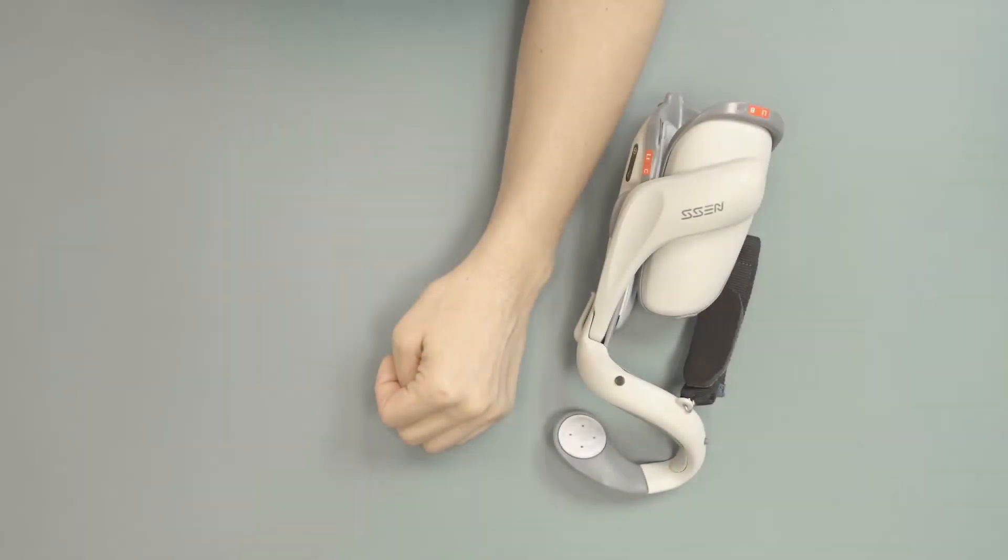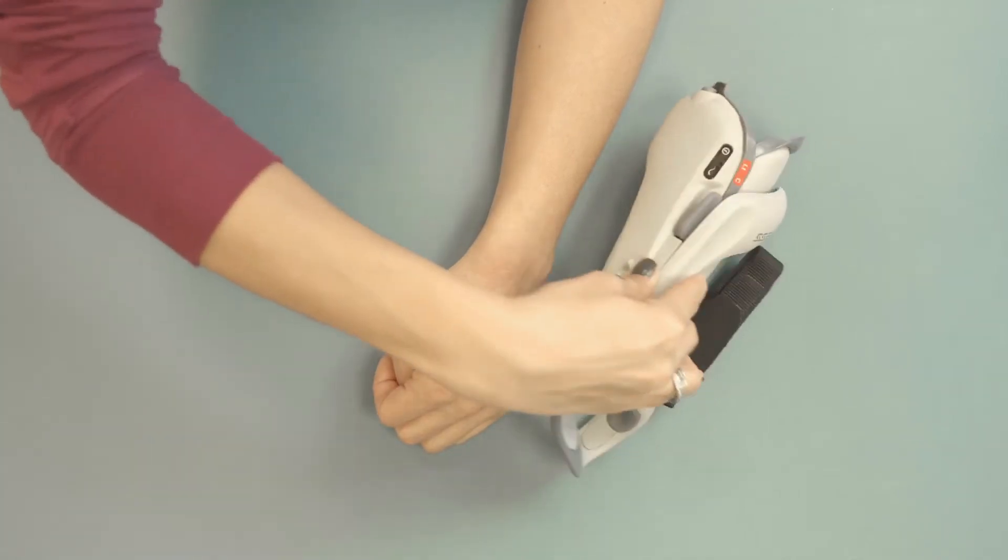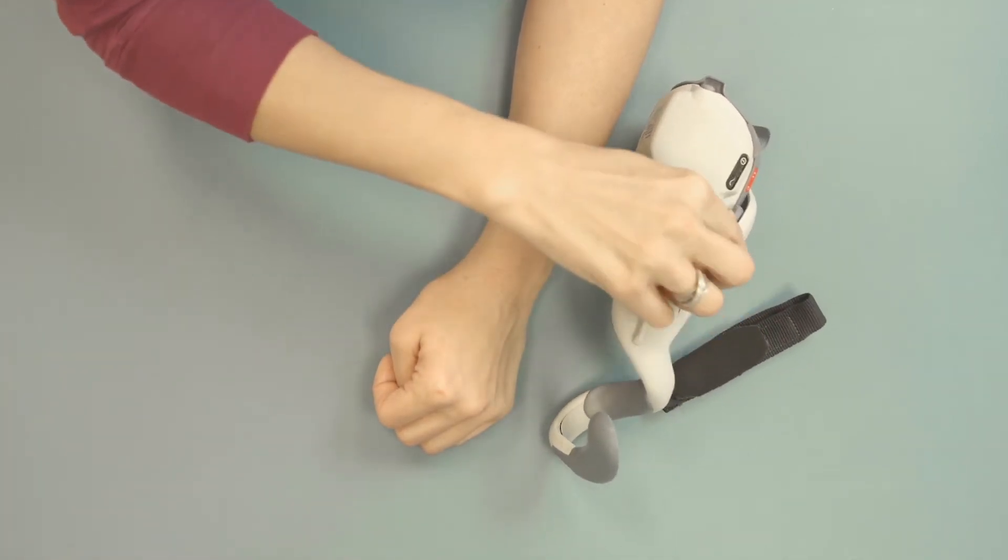Begin by placing the H200 orthosis on a stable surface like so. Open the extensor wing by gently squeezing the purple tab and sliding it away from you.